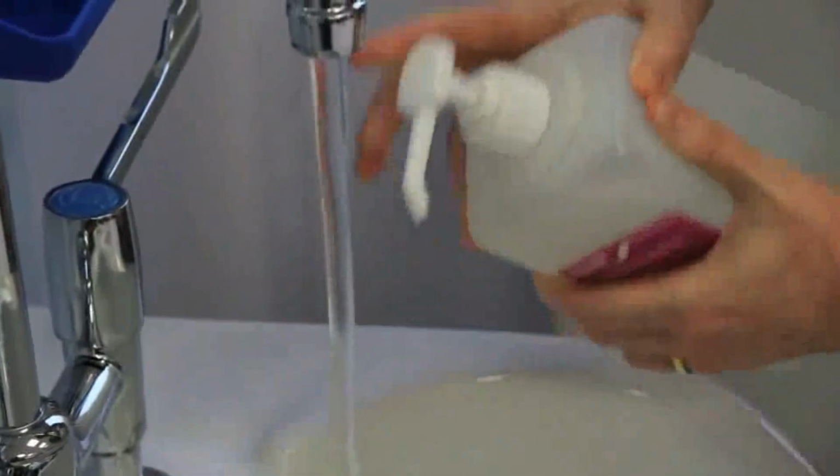Some ladies do experience a very small amount of vaginal bleeding after using the dilators. If this happens, don't panic. If, however, the bleeding becomes heavy, or if you notice any vaginal bleeding at times when you haven't been using the dilator, then please consult a health professional.